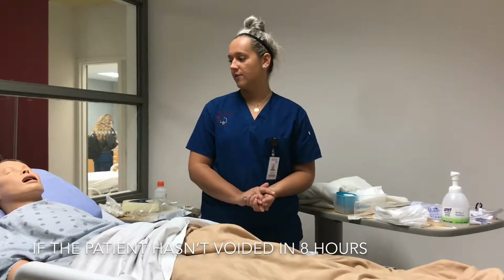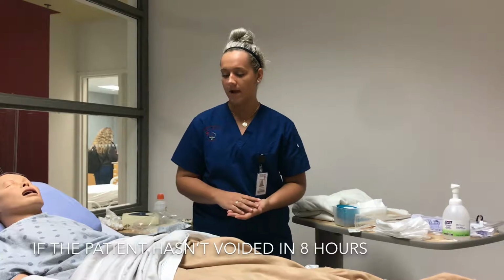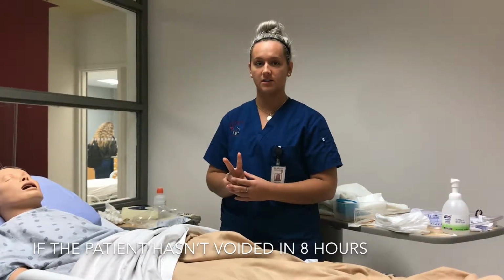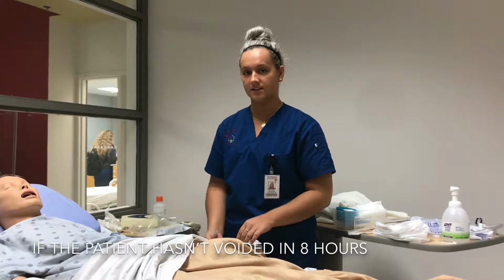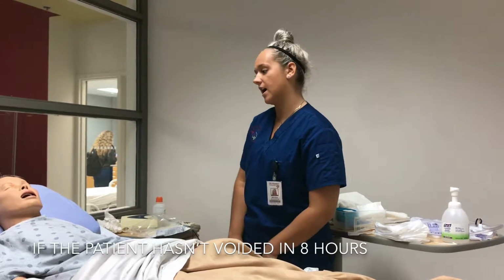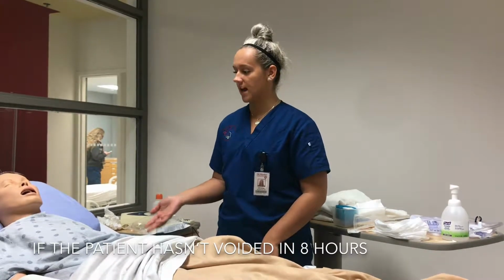Okay, so I would start by introducing myself to the patient, and then I would begin by identifying the patient with two identifiers. So I would look at his hospital tag and ask him for his full name and his date of birth. And then after that, I will begin by explaining to the patient why this procedure is happening.